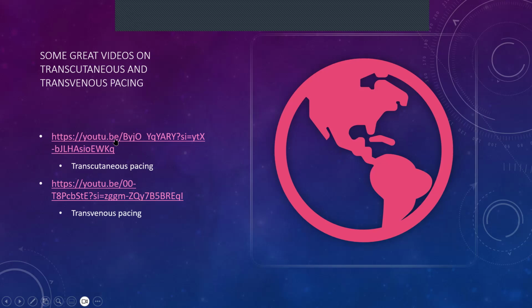So these are 2 videos that are extremely good on transcutaneous pacing and transvenous pacing, which are things that people don't necessarily know how to do. So transcutaneous pacing is basically where you place the pads on the patient's chest, and then you start to pace them from there. And transvenous pacing is similar to putting in a CVP, but you put the CVP with an electrode in it so that it stimulates the contraction of the heart.